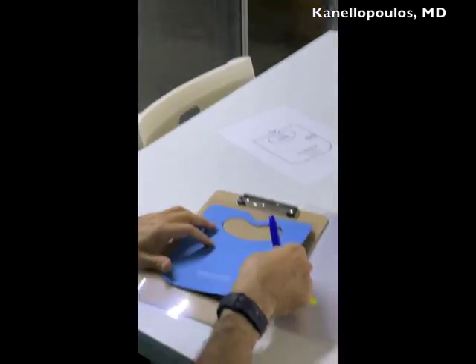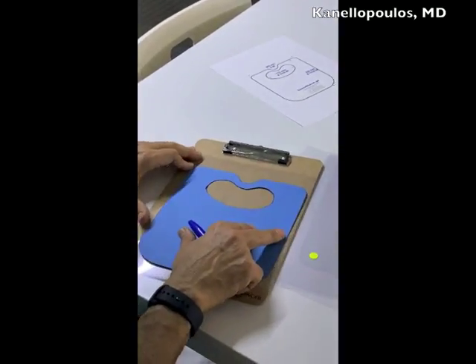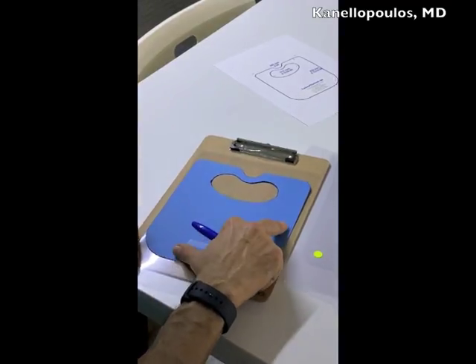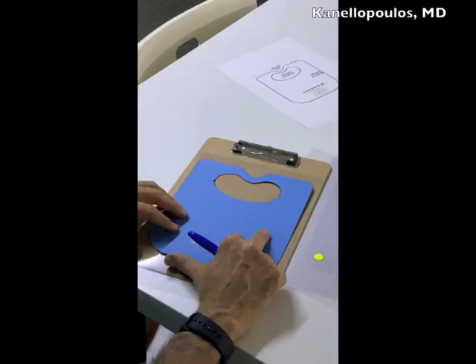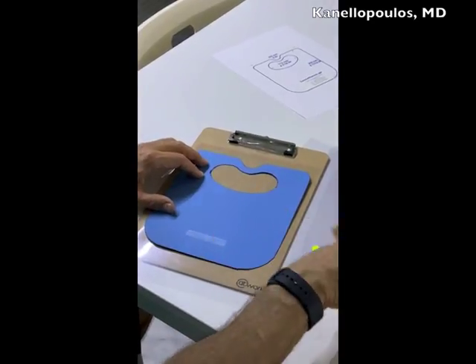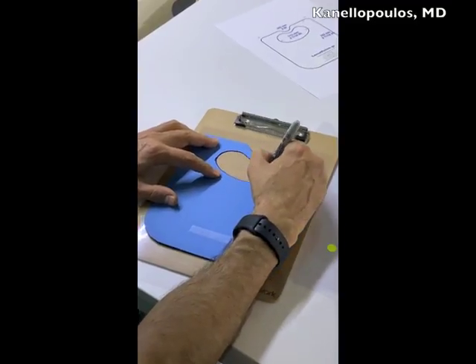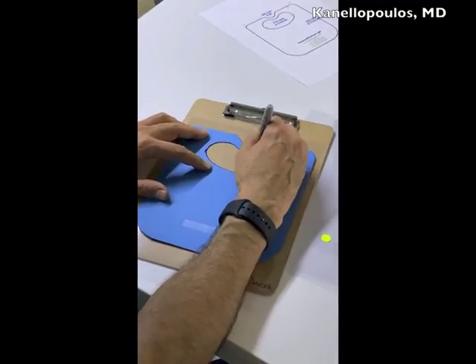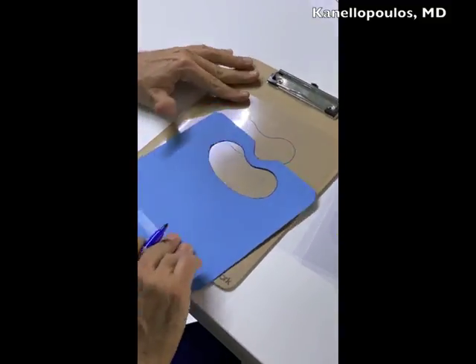So we're gonna place this, not tilted, at the edge of this. The size here is a letter size cellophane. We're gonna go 1 inch under, and we're just going to mark the opening. It's kind of fun to do. So this is all we need to do.